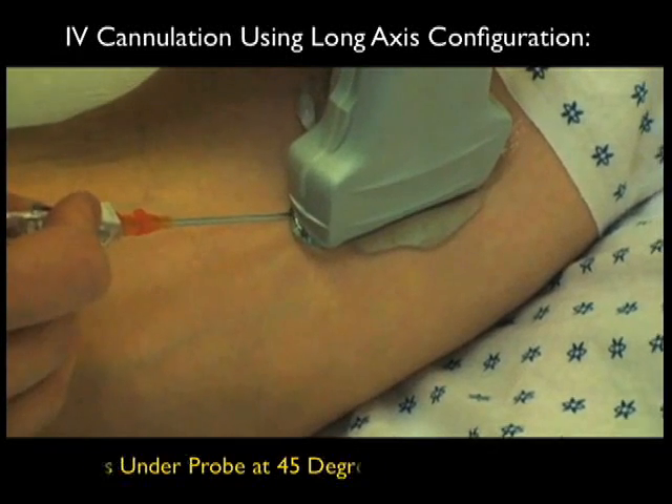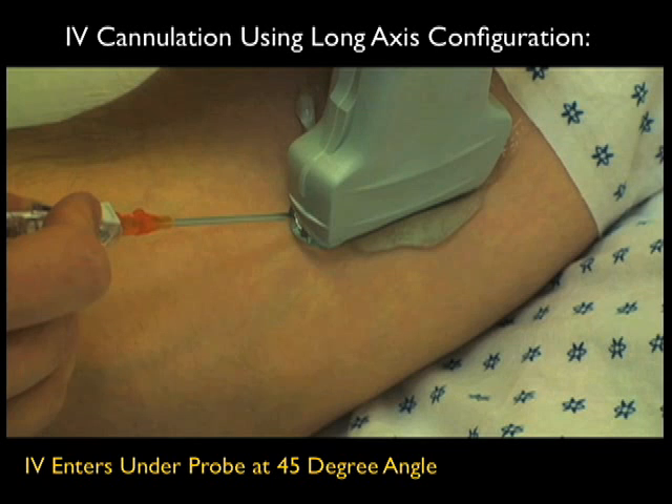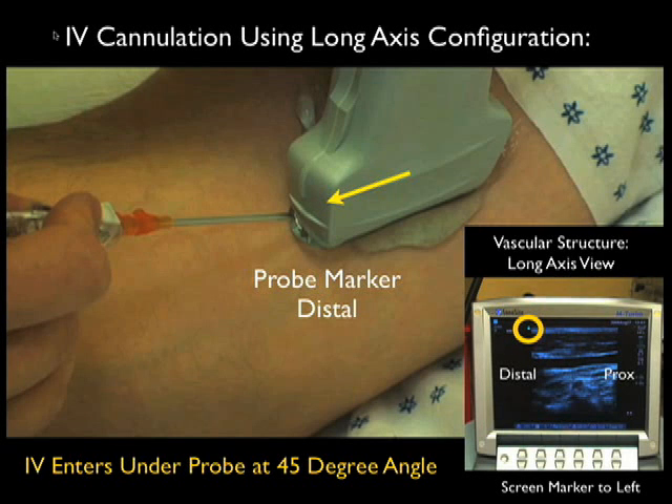Here's an example of an IV cannulation using the long axis configuration, which as we talked about is good for two things: knowing the course of the vessel up and down the arm, and knowing the depth of the vessel with regard to the needle tip. Notice here the IV is coming at a 45 degree angle underneath the distal aspect of the probe, which would be located towards the left of the screen. Therefore, look for the needle coming in from the left of the screen and going towards the right.